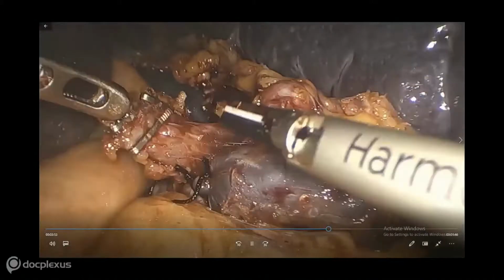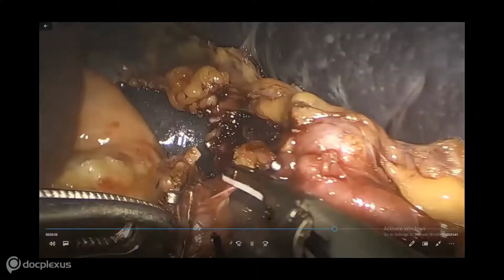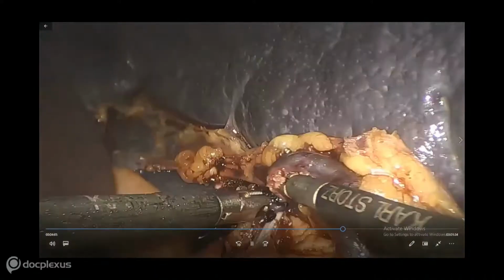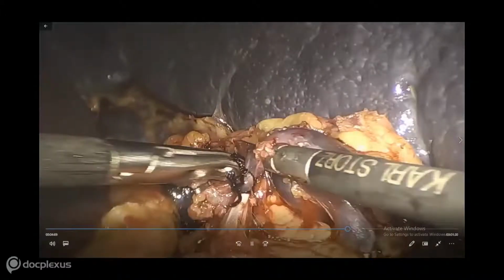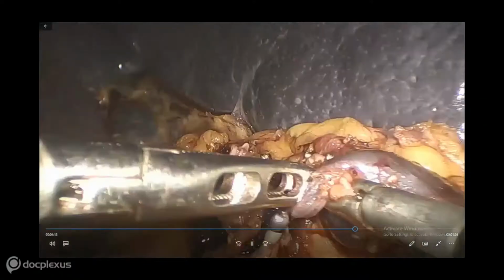Here you can appreciate we have put 2 ligatures, and the vein is distended now. Then the third ligature is very difficult. So whenever you want to ligate it, first ligate it here, and then do other ligations on the distal side. The flow is from this direction, so you always ligate proximally, then come distally.